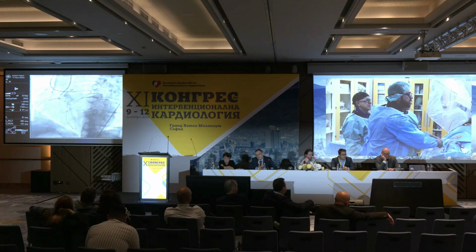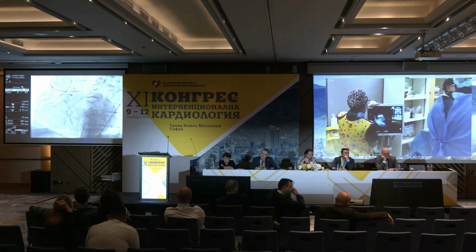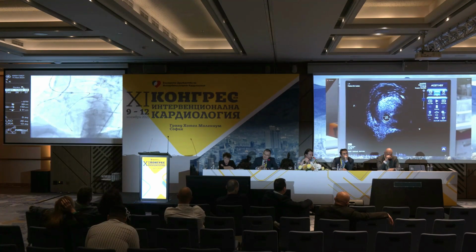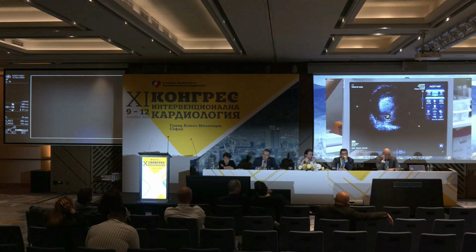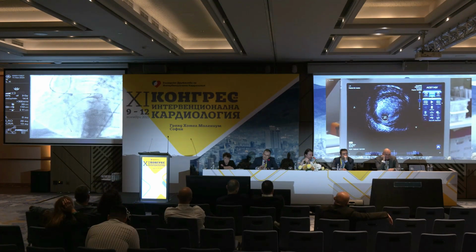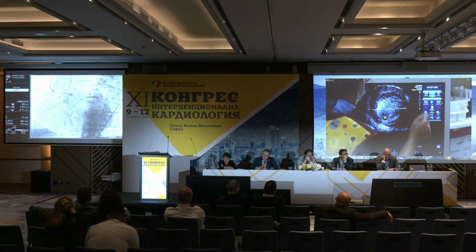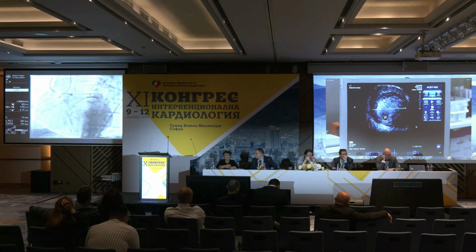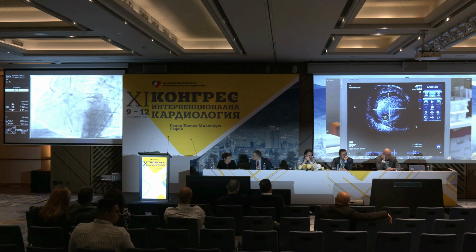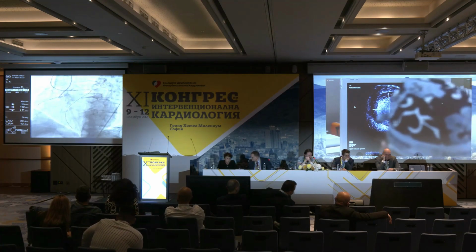There is no doubt that if you see it angiographically, the ostium is subtotal. Absolutely. You can clearly show it. The point is, probably the size of the stent will be 4.0, but you should optimize the proximal part. We will post-dilate with 5, yes, the ostium. So, Dr. Gelev, do we have what kind of stent we want? You saw that I played the last angiogram for you. It will clarify to you the situation in the ostium. We can appreciate it there.